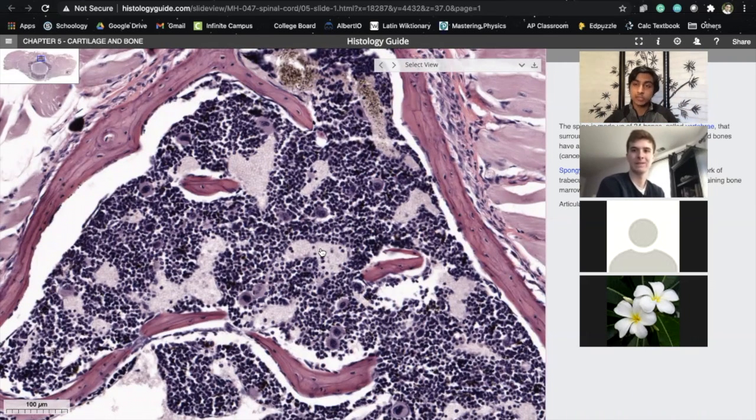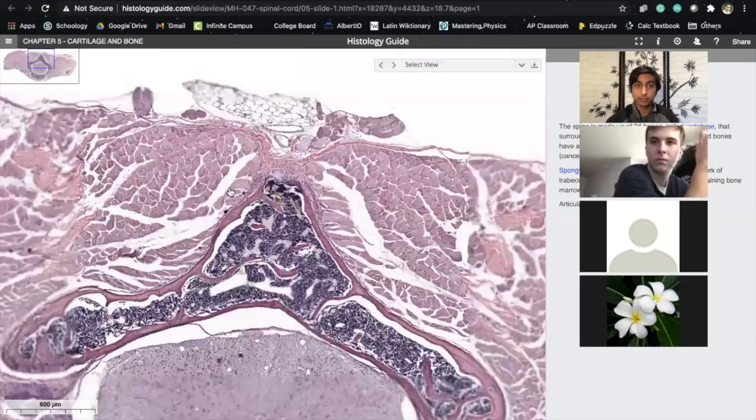The actual cells that are there are very different. And so they look very different on histology. And so if there's something wrong, you can make a differentiation between what is this? This is normal, right? From what a pathologic example could look like.